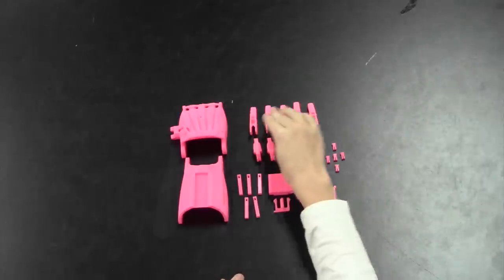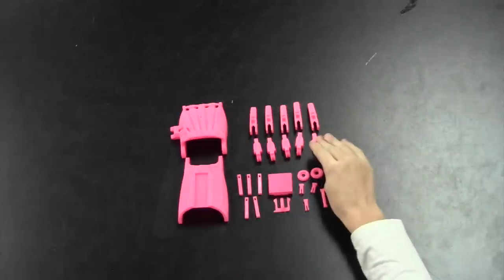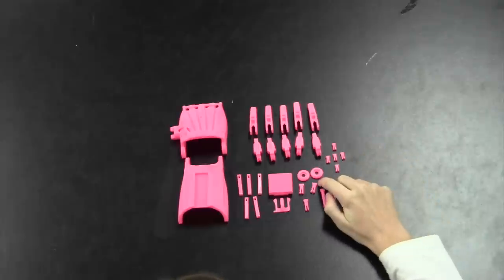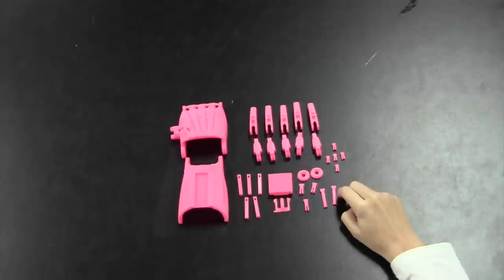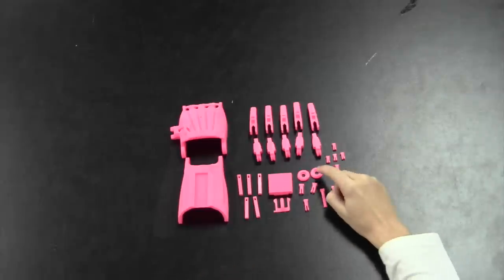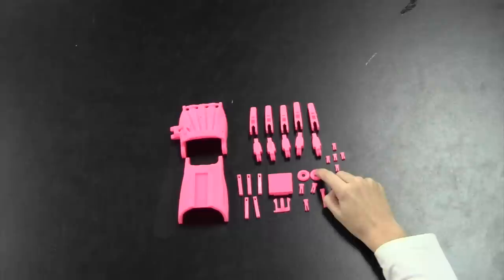First you'll need five fingers, five knuckles, five finger pins, two wrist pins, two knuckle pins, and one thumb pin. You'll also need two wrist pin caps.